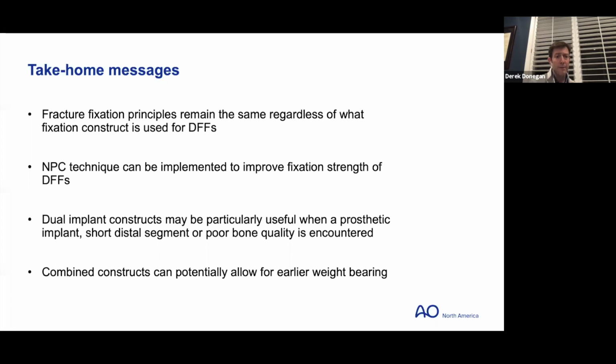Fracture fixation principles remain the same regardless of the fixation construct. So remember, for articular injuries, anatomic reduction, absolute stability, restoring and maintaining the length, alignment, and rotation of the femur. Nail plate or plate nail technique can be implemented to improve your fixation strength. Remember, the density of fixation distally is significantly increased, and has been shown to broaden and unify the stress load across that distal femur.